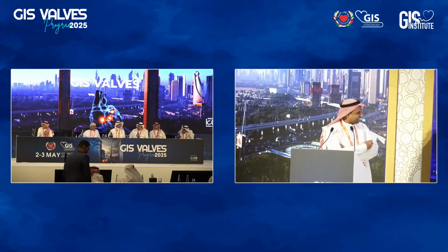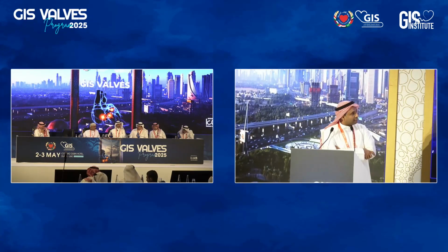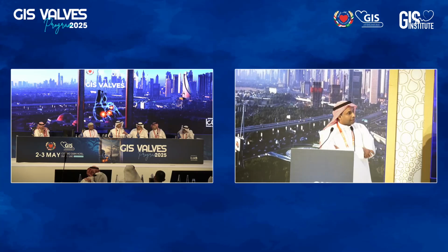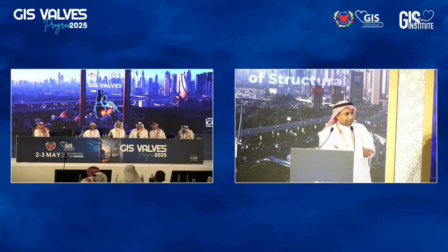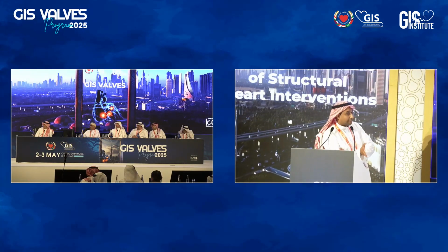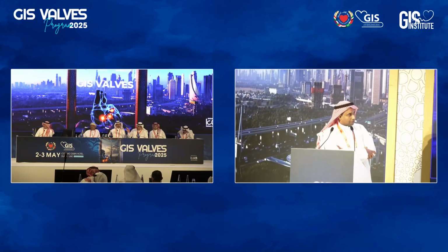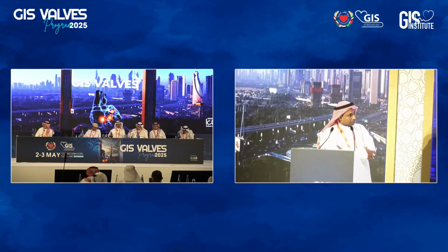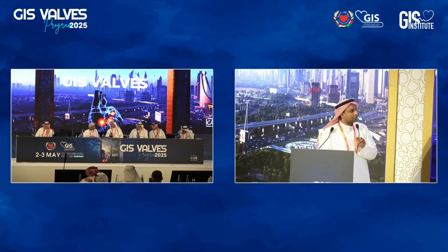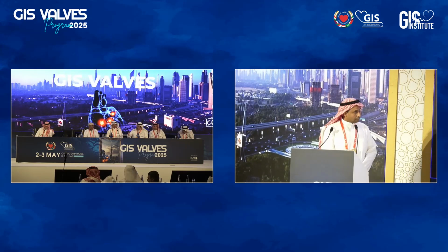Two comments. First, from the transthoracic, when you see the MR is horizontal, that's not mild or moderate. This is severe. So it was missed. That was severe MR. Actually, this is not in the cath lab table. This is actually day 2, about 12 hours after the procedure. But when you see it horizontal, like the one you saw in the apical 4-chamber, it is a horizontal jet of MR. That's severe MR. It is severe, but actually the surgeon put only an annuloplasty ring. Definitely, they did put a patch on the leaflet. No, I'm talking about the immediate. Sure. But the TEE clarified it more.